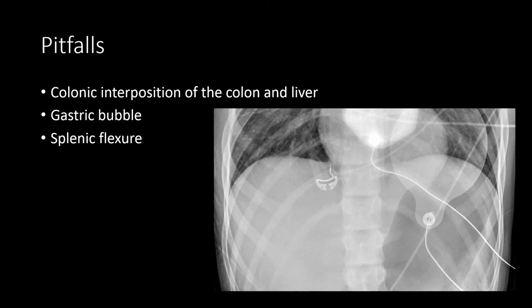Remember there are some pitfalls. The colon can sometimes become interposed between the liver and the diaphragm and can mimic free air in the right upper quadrant. In the left upper quadrant, the gastric bubble and the splenic flexure can often mimic free air. In this case, you see a very distended gastric bubble that almost looks like free air. Notice there does remain some separation between the diaphragm and that gastric bubble, and that is a normal finding.